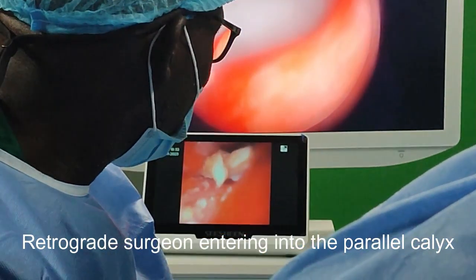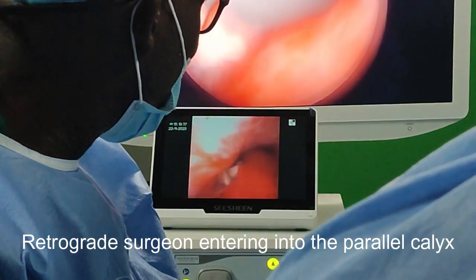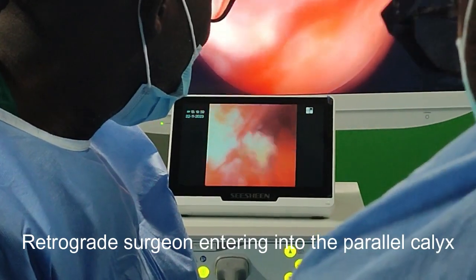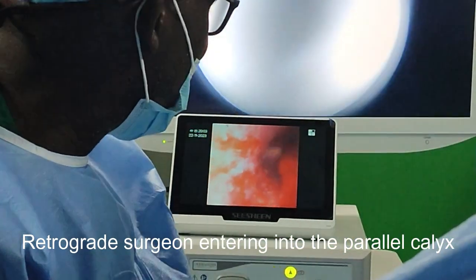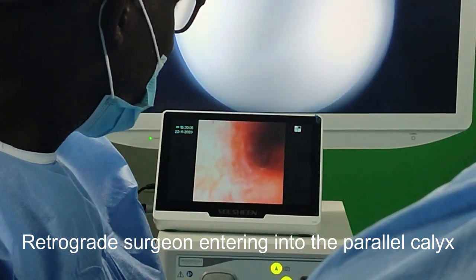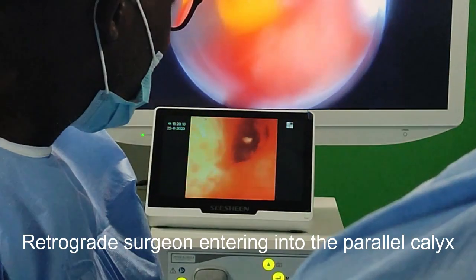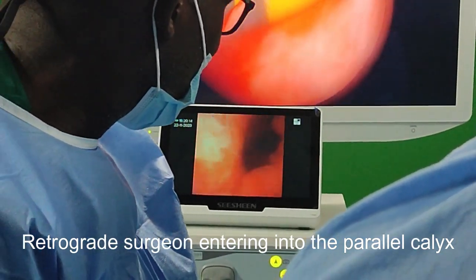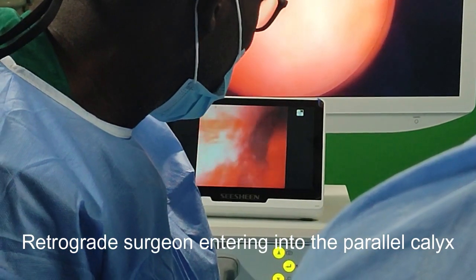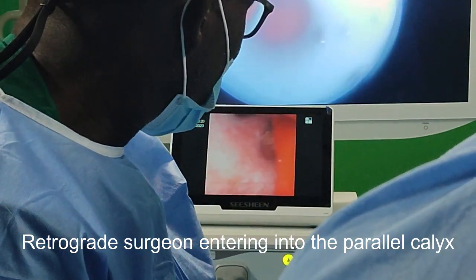Okay, so it has to come out. You see, you are blocking it without it coming out. And with water, somebody to. So what do you do, madam? Not complete. So that it comes out. You have to come out. Go in again. You have to basket it and give it to me. Hand it over to me.